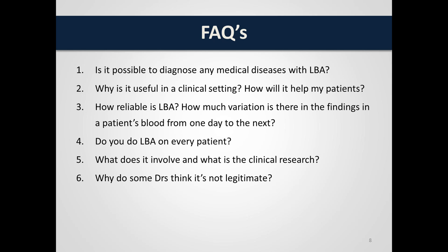Thank you. And how close is live blood analysis to normal hematology? Well, that's actually quite an interesting question because, as I said earlier, a fair degree of information in live blood analysis is purely based on standard hematology. So in terms of the specific anomalies that we also see and recognize in conventional hematology, the interpretation would be very similar. So from that perspective, it's very similar to conventional hematology. But there are, of course, also some very fundamental differences. The fact that we're looking at live blood makes a very big difference.